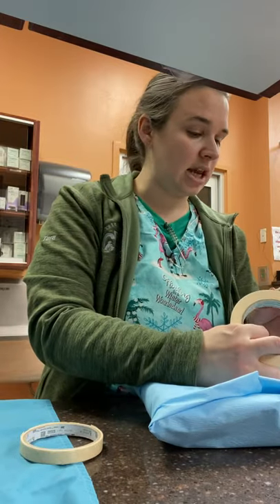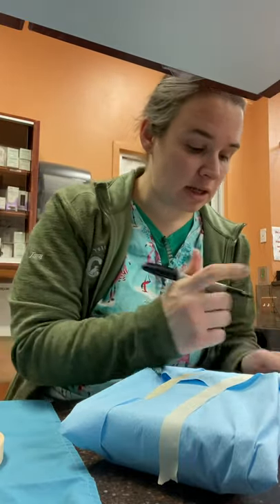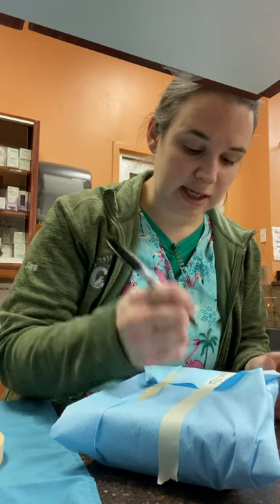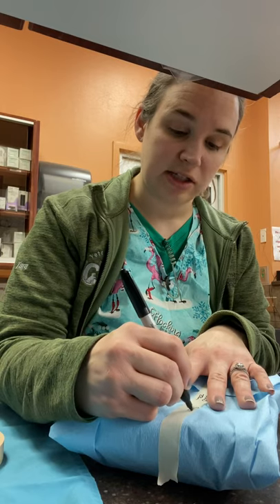We use the indicator tape and another tape to help secure it. Then we label what our pack is — this is our general surgery pack. We place today's date on it and our initials, and we'll put 'sterilized' on.